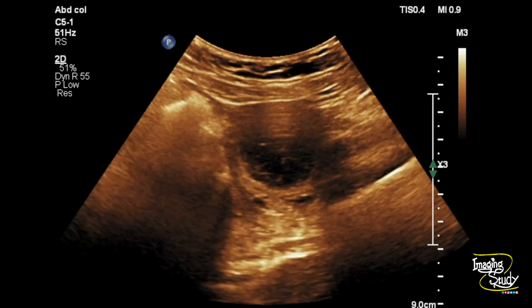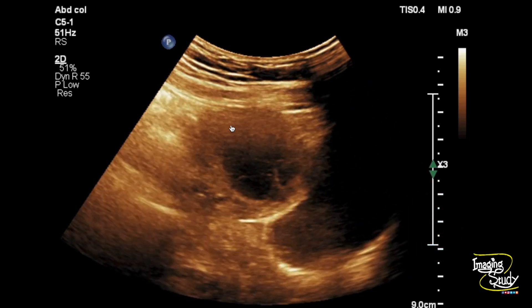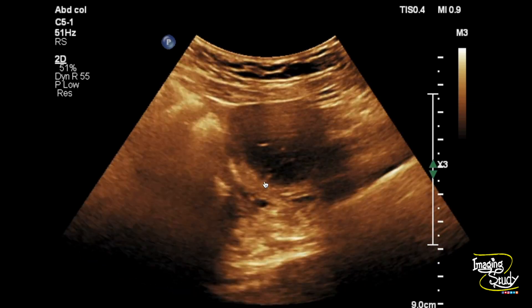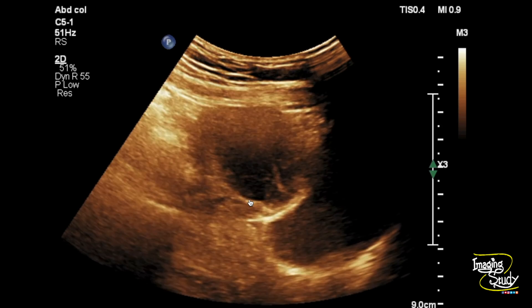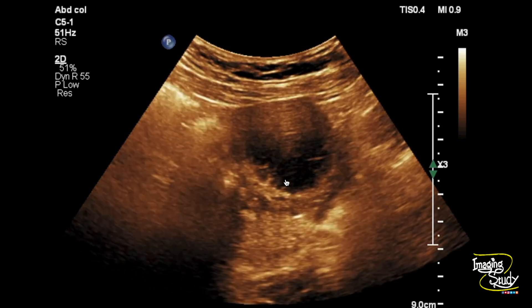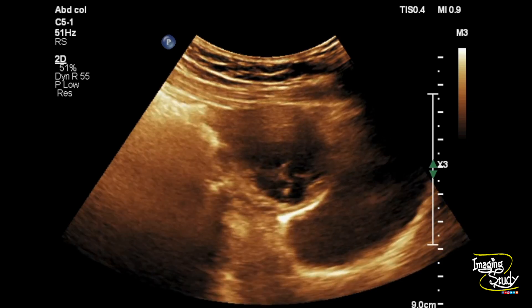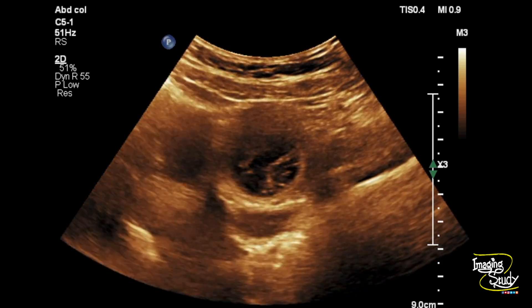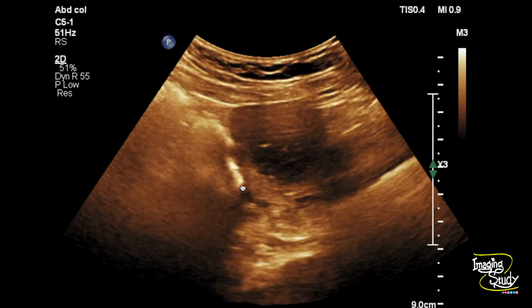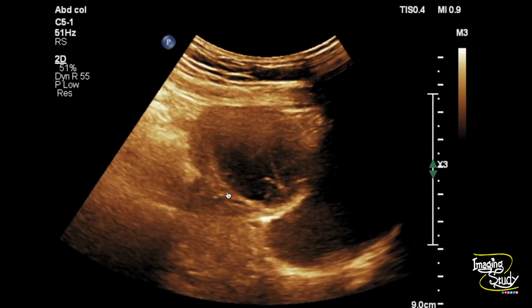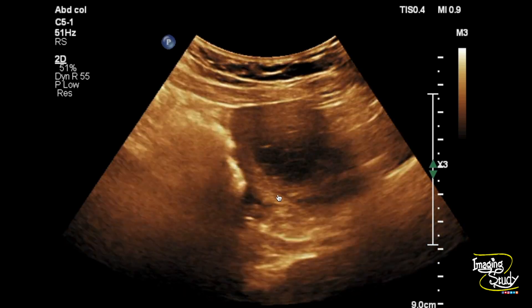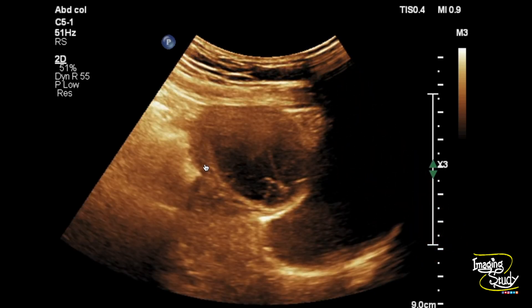Here you can see the longitudinal and transverse sections of the pelvic region. You can see an oval to round anechoic cystic area with internal reticular pattern. This internal reticular pattern is suggestive of a hemorrhagic cyst. If you look carefully, you can see the surrounding thickened area, which is the ovarian stroma, indicating it to be of ovarian origin.